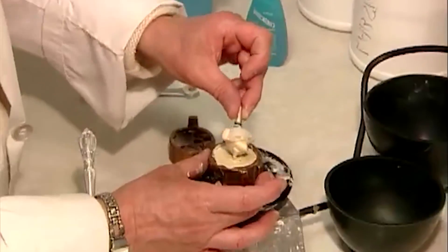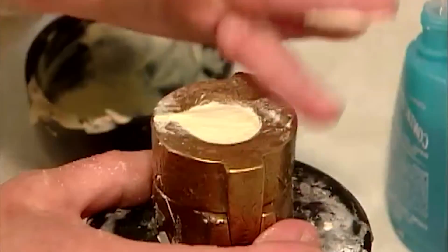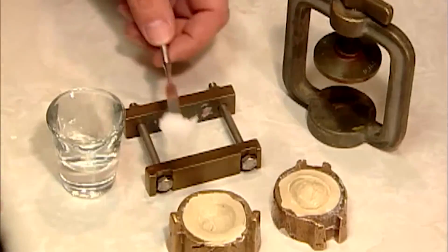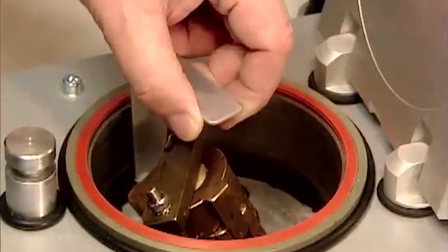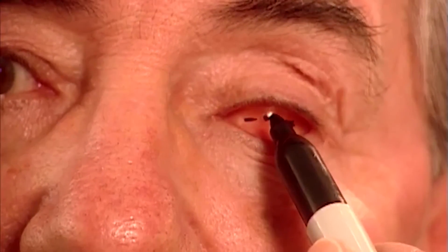After the impression is taken, it's time to make a mold. The impression is placed in a mold and plaster is poured in. After the plaster hardens, the impression is removed, leaving a plaster mold of the socket. A wad of acrylic plastic dough is poured into the mold, locked in a press, and placed in an oven to cure. The acrylic model that emerges is known as the fitting shape, used to fit and mark the position of the fake iris.